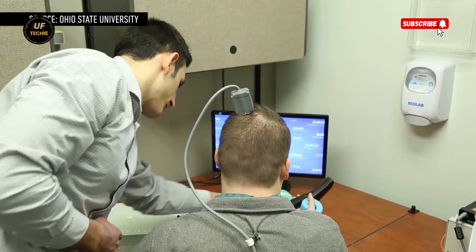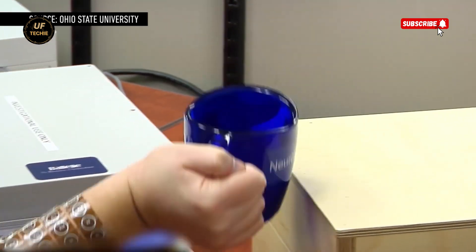That would make the device portable and usable in everyday life. Ian isn't the only one to benefit — four more participants have been approved to test this technology, which means this isn't just an isolated case. It's a glimpse into the future of mobility and independence for people living with paralysis.